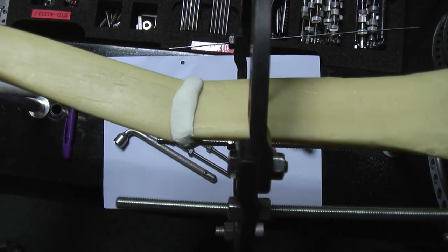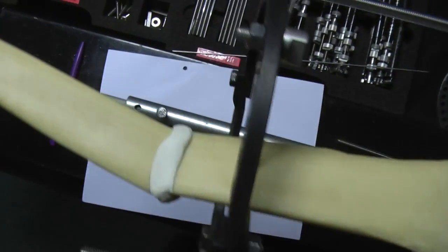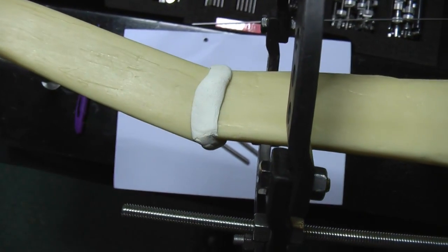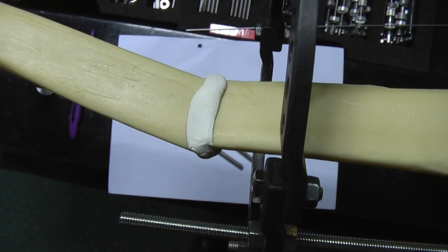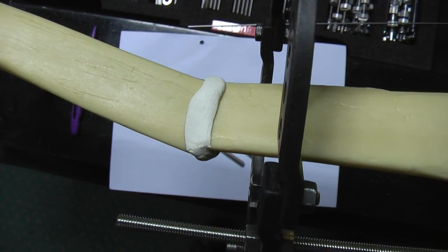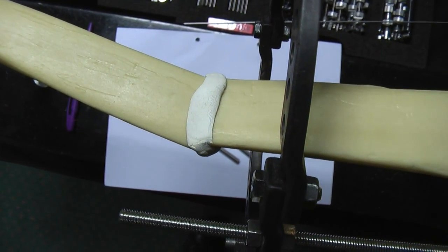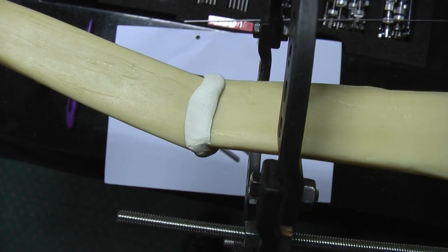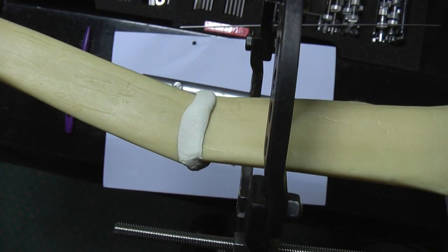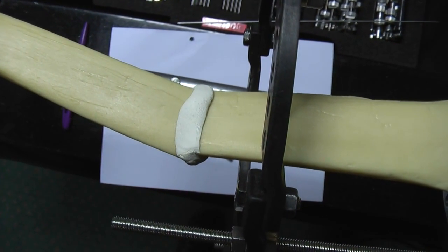Now, there we go. Can you stand still there and hold it there? Can I convince you then that as we look at this as an AP, if I was to put hinges here, the bone would just come straight. If I was to put the hinges down here, the bone would come straight and lengthen.